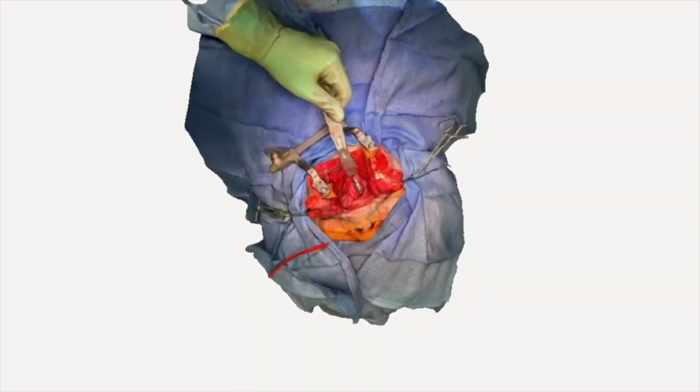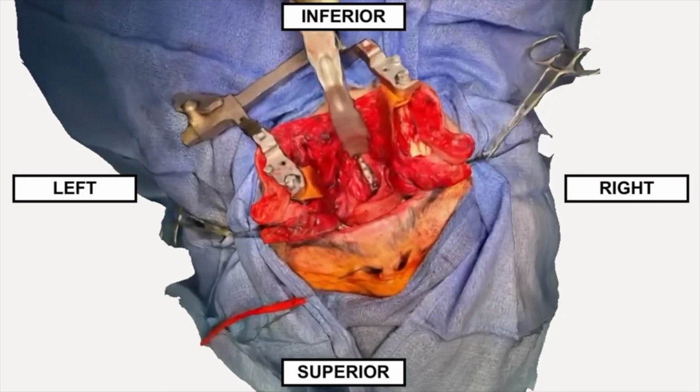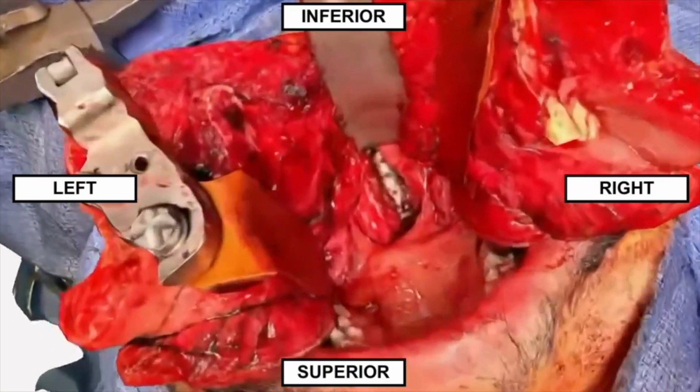To summarize, here is a 3D video of the transoral transmandibular approach to the anterior cervical spine.